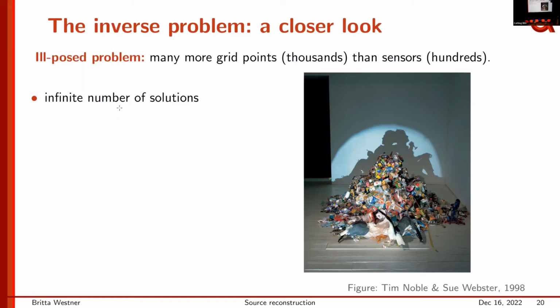This art piece by Tim Noble and Sue Webster is playing with exactly this fact: that if we increase dimensionality, there's an infinite number of solutions. So this is our source that we want to estimate. I hope your data is not a pile of garbage.